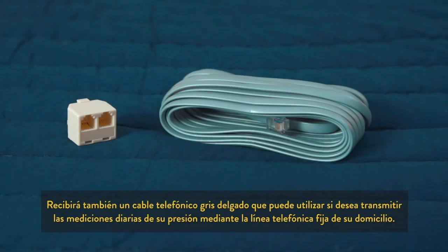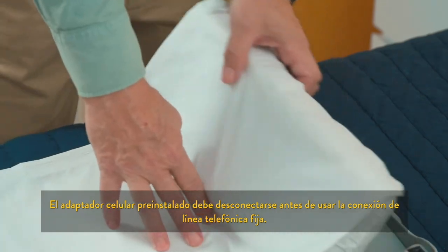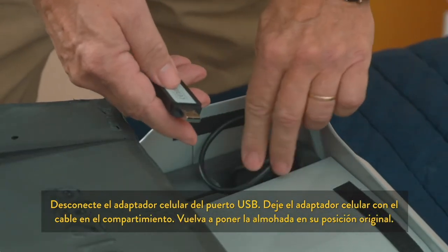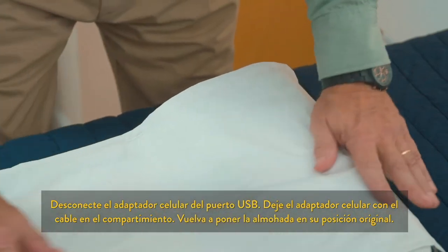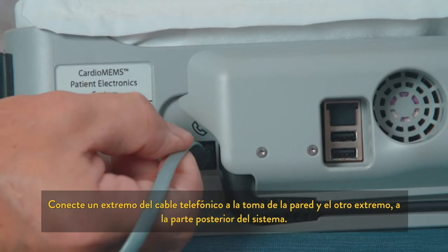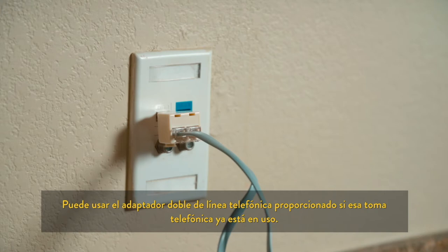You will also receive a thin gray telephone cable that can be used if you transmit your readings using your home telephone line. The pre-installed cellular adapter must be disconnected before using the landline telephone connection. To do this, lift up the pillow from the headrest to reveal the USB chamber. Disconnect the cellular adapter from the USB port and leave the cellular adapter with the cable in the chamber. Return the pillow to its original position. Connect one end of the telephone cord into the wall and the other end into the back of the system. The provided telephone line splitter may be used if the telephone jack is already in use.